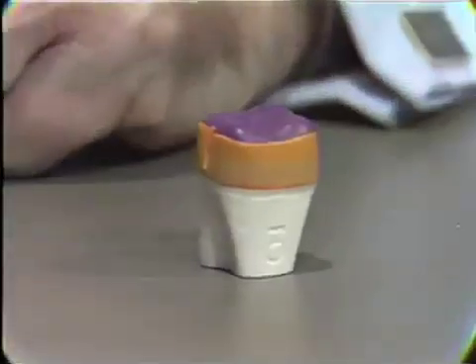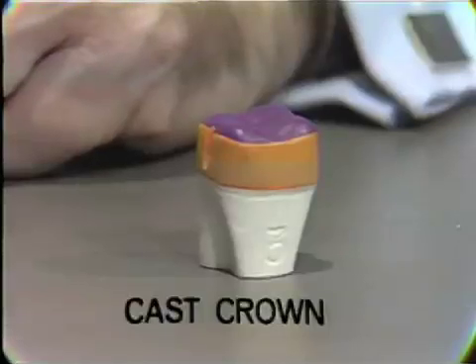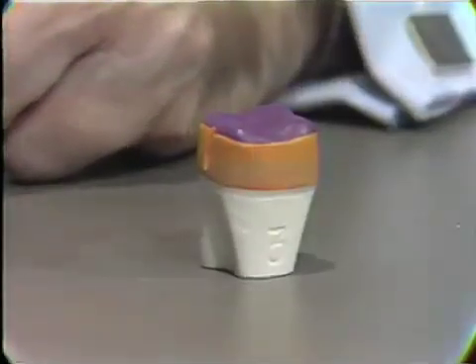The next type, or the next modification of the complete crown, which we should perhaps take a look at, is the cast crown, which is used on posterior teeth. This is a complete crown preparation in which there is no aesthetic facing. The whole crown surface is in gold, and it is, of course, only used usually in the mandibular molar teeth, occasionally in the maxillary molar teeth.